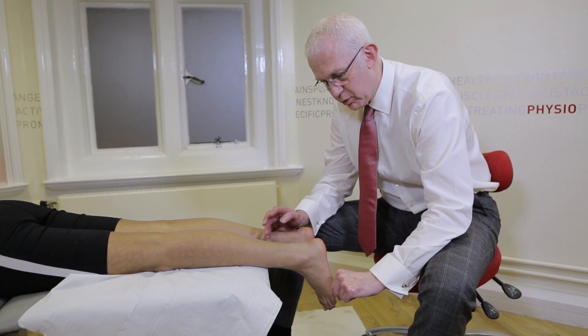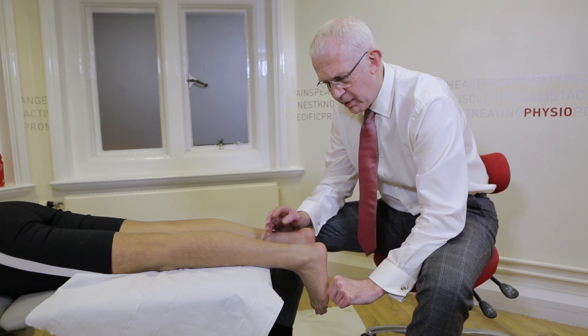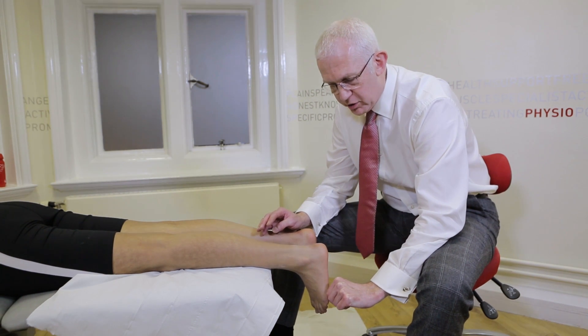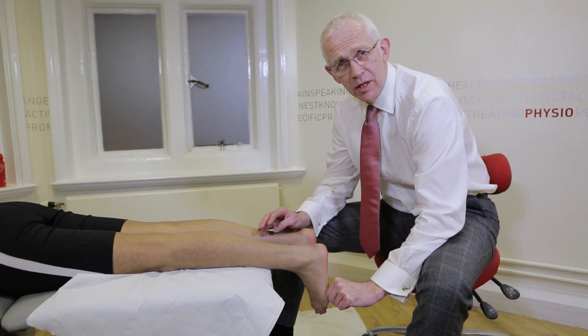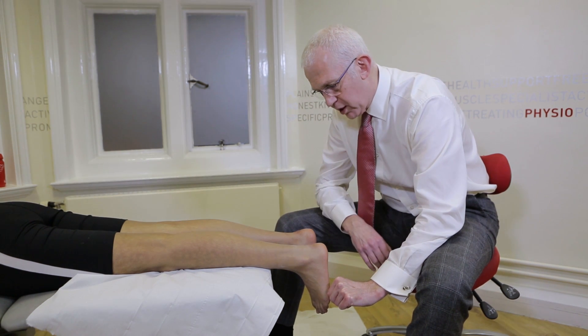It's quite common for people to use the thumb on the fourth and fifth metatarsal heads to do the same, but I quite often see people putting too much pressure on there. And obviously you get an indentation on the plaster cast, which can sometimes skew the quality of the cast.